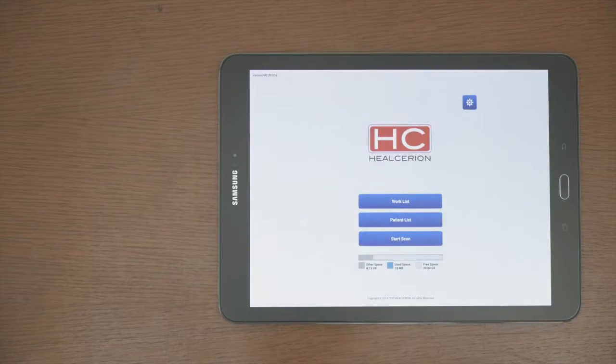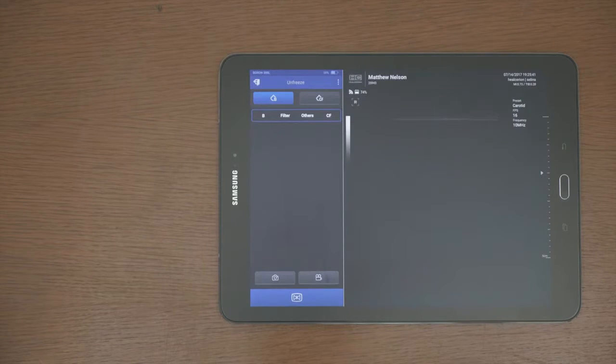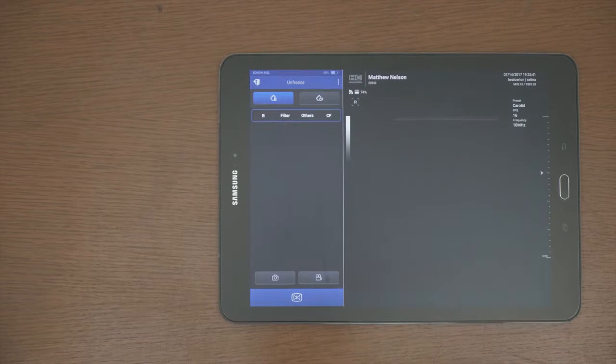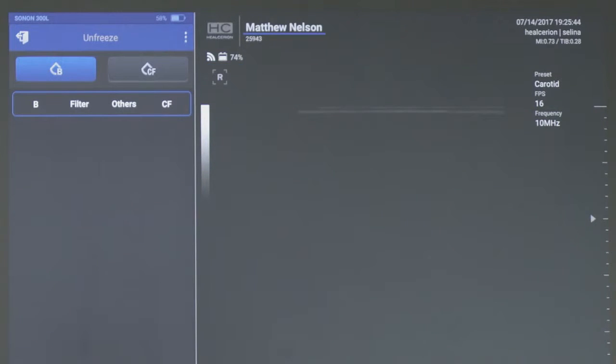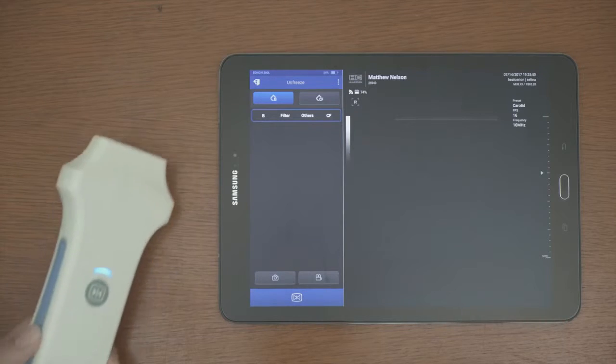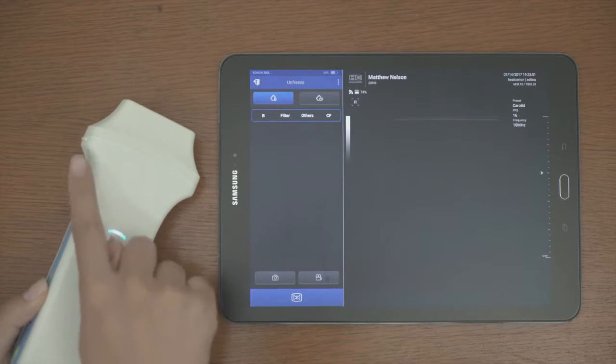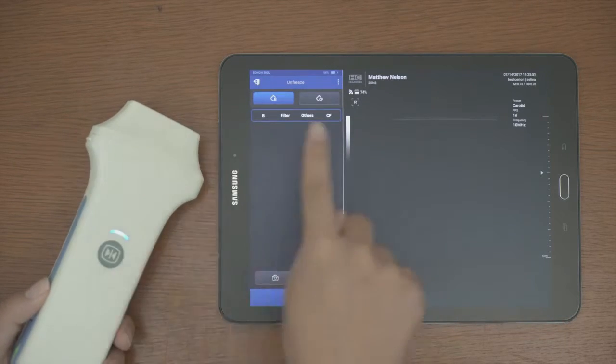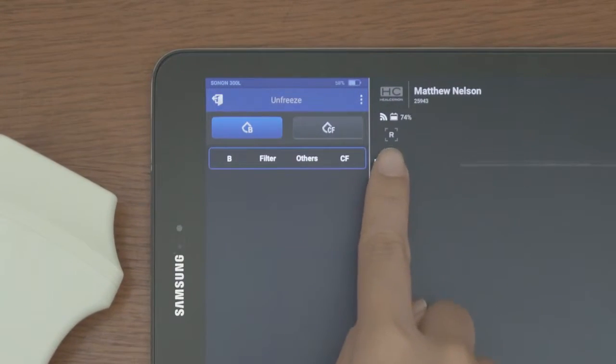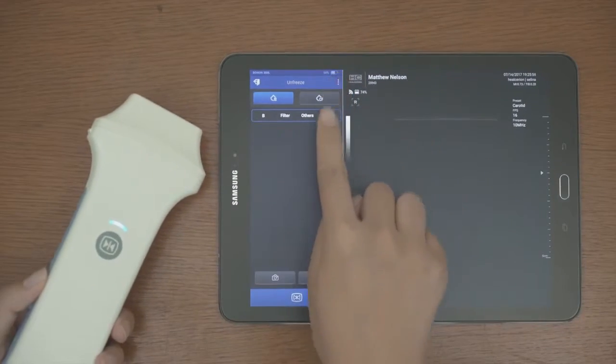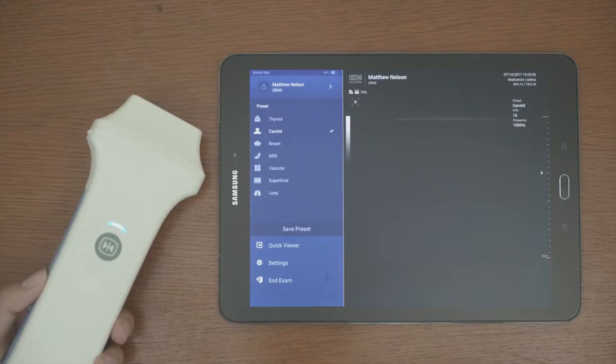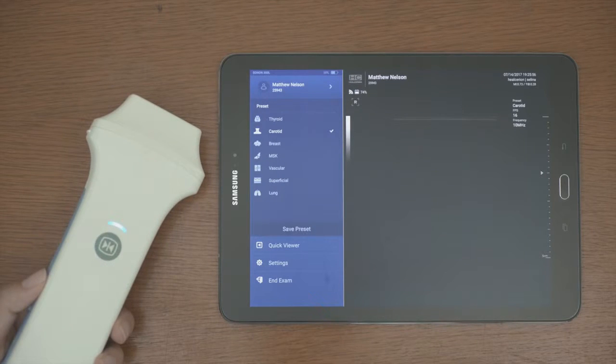The scan screen displays the connection status of the Wi-Fi connection and remaining battery status. Identify the patient's name and ID and match the R mark to the transducers line one marker. Before starting to scan, set the preset from the menu button.